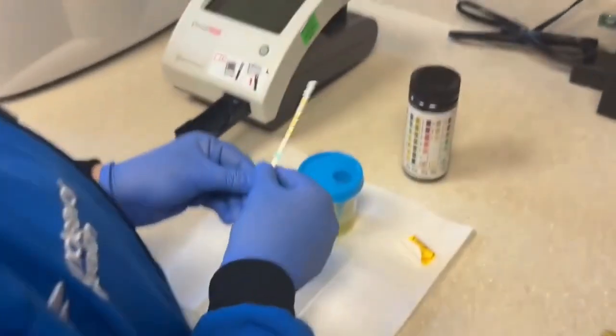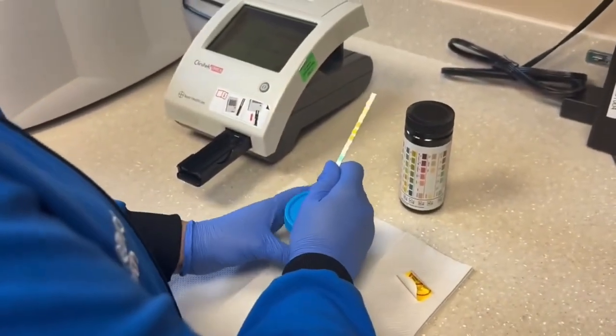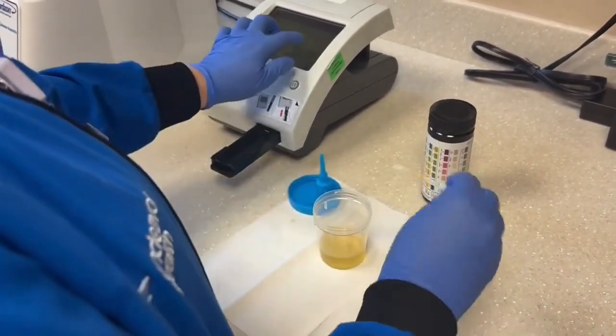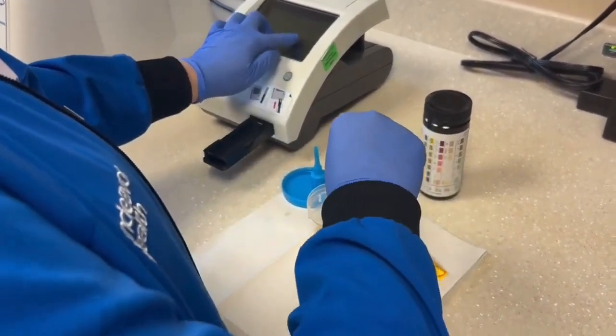Next we'll remove the lid from the urine specimen cup. Once you press start on the Clinitec, you have eight seconds to dip the strip into the cup and place it on the table.